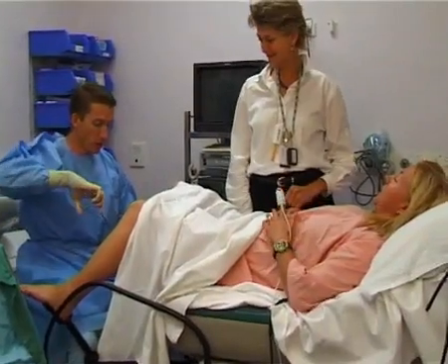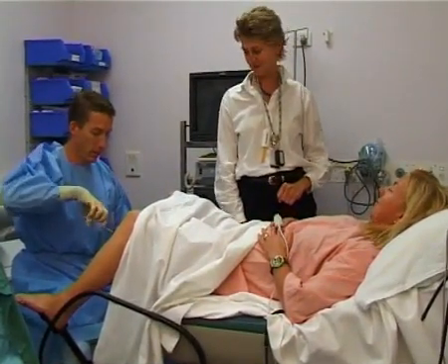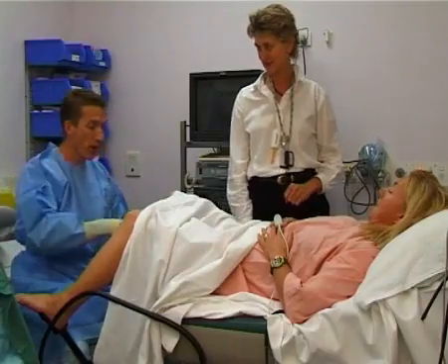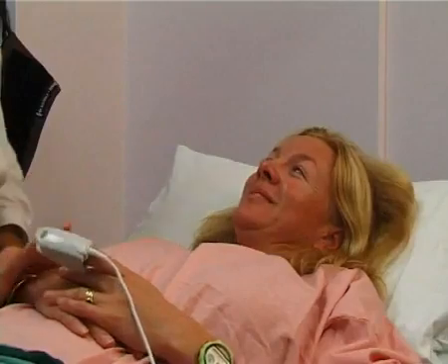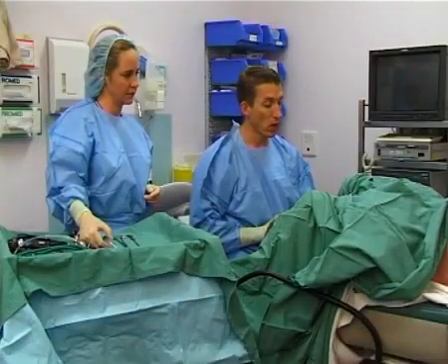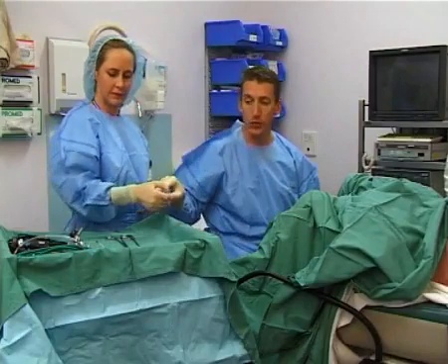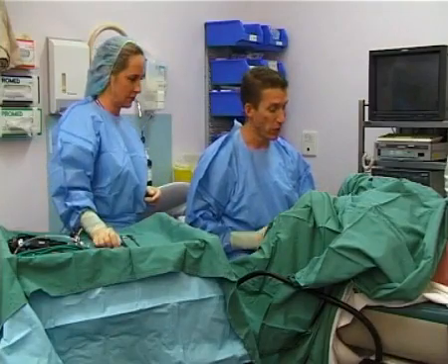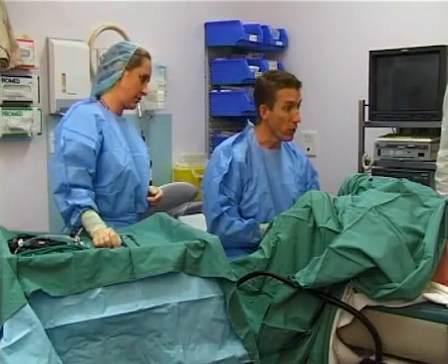We perform approximately 130 outpatient hysteroscopic procedures per year. Our success rate for the year 2005 was 93%, and insufficient samples for analysis were recorded in 14% of cases, mostly in postmenopausal women with a diagnosis of endometrial atrophy. This video illustrates the method of outpatient hysteroscopy as practiced in our unit.